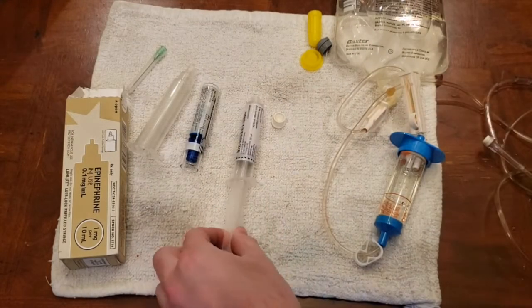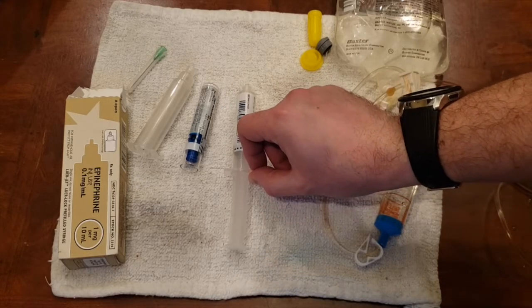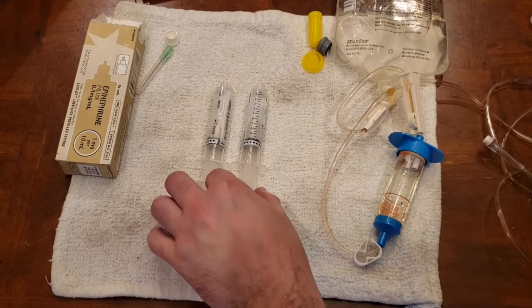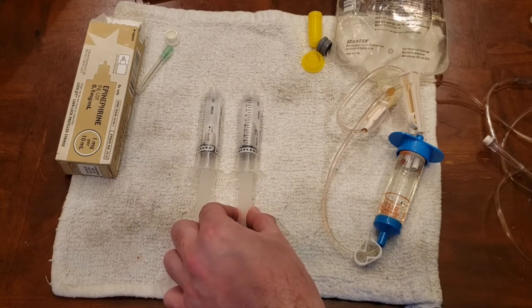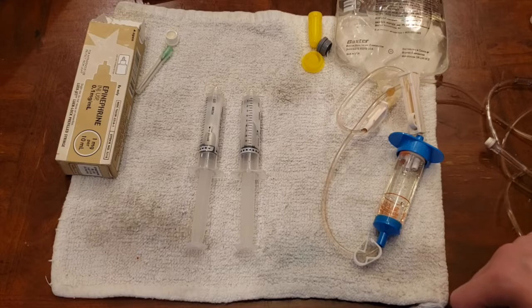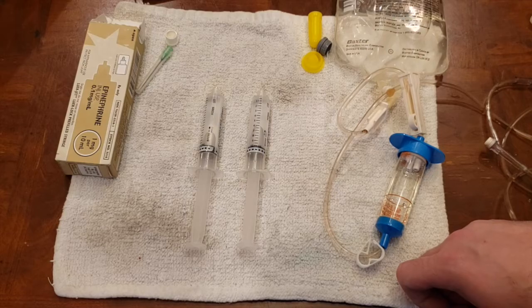Although that is a method that will still give you the same concentration of epi for your push-dose, here's the problem: which one of these contains push-dose epi? One of these is a regular saline flush, and the other one has epinephrine in it. If you're using a saline flush to dilute your push-dose epi, you're increasing the risk of an error — you may inadvertently pick up a saline flush thinking it's push-dose epi, or more dangerously, pick up a push-dose epi thinking it's a saline flush, and push the entire amount into the patient at once, thinking you were flushing another medication with saline.